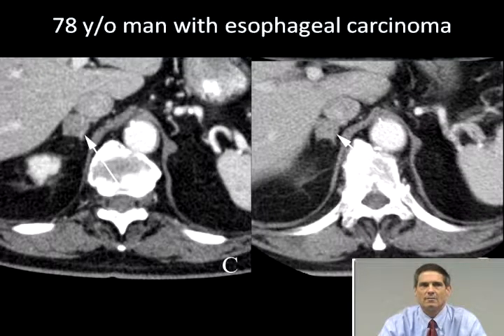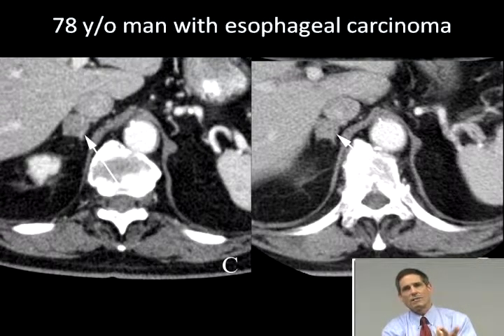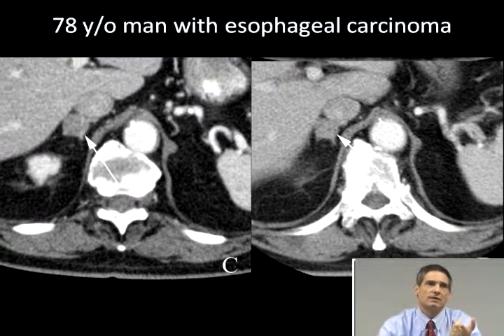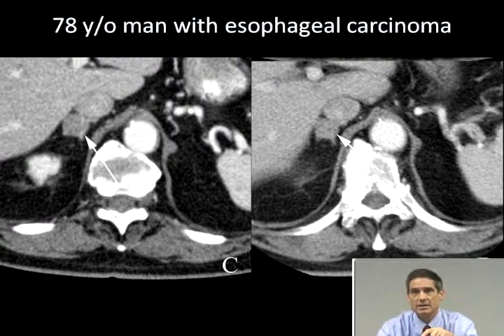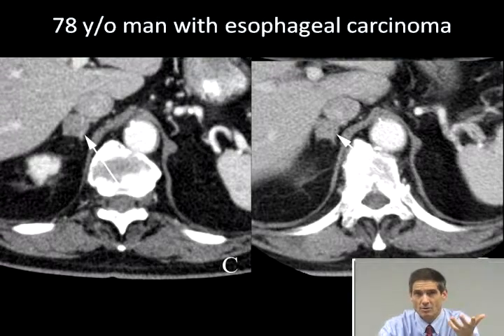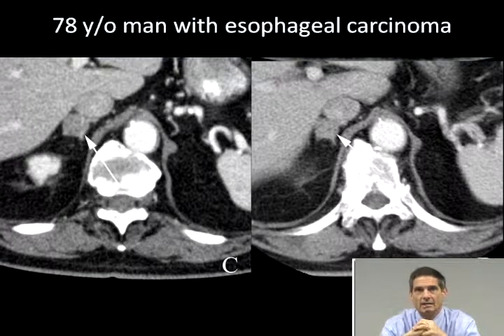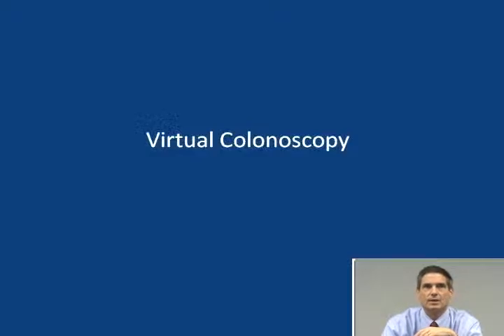What about this case? Here's a 78-year-old man with esophageal carcinoma, and he had a lump. The image on the left, the CT, was done for workup for the esophageal cancer, and of course when you have an adrenal lump and any malignancy, you're thinking it could be a met. Fortunately, this guy had an imaging study on the right, which was done 8 years earlier. The lesion had undergone no interval change, and in this case you are done, because you've got all the follow-up you need, and it's a benign adrenal adenoma.